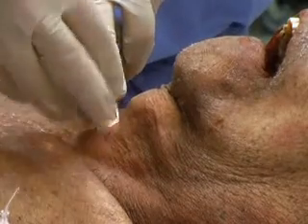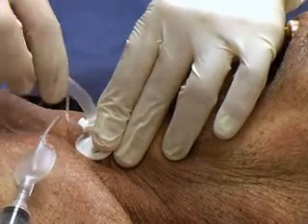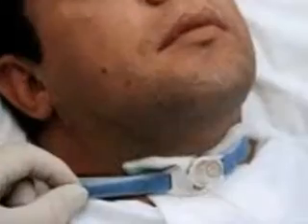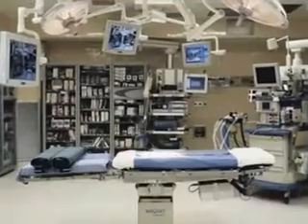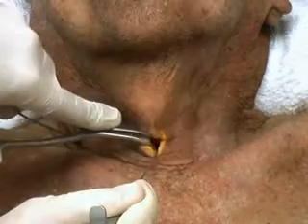A cricothyroidotomy performed under emergency conditions can be left in place for up to 72 hours. If a surgical airway is still necessary after 72 hours, the cricothyroidotomy should be converted to a tracheostomy. While tracheostomy is preferred for long-term management, it should be performed in the controlled setting of the operating room. In urgent situations, cricothyroidotomy should be performed.